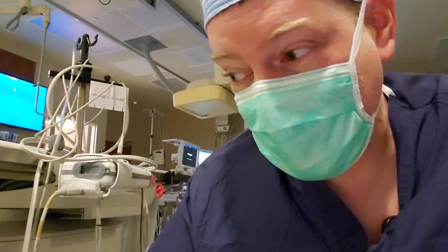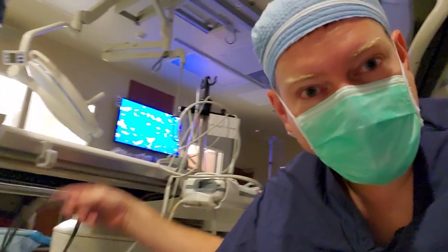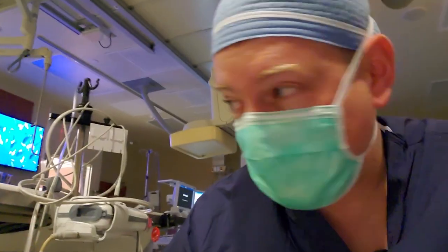So this is a real big problem because, yes, some people will argue that it's not the biomed's job, but at the same time, guess who's going to have to deal with it when problems come up? It's going to be us. So I like to try and deal with this stuff, and when I find it, I'm not babysitting the users. If anything, I'll take a photo and send it to the user saying, hey, this shouldn't be happening like this. Make sure that when you're finished with a case, you unwind your cables. That way you can clean them effectively and they can be safely stowed. But this, data cables and stuff just thrown all over the floor, it's unacceptable.